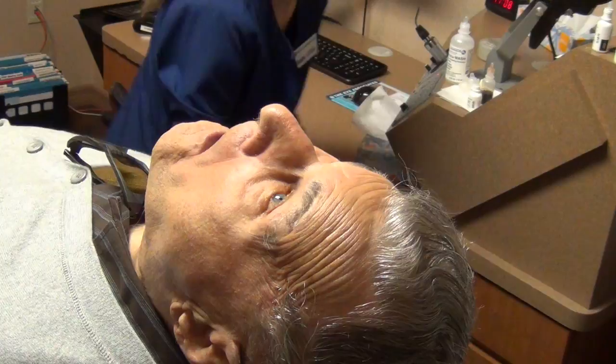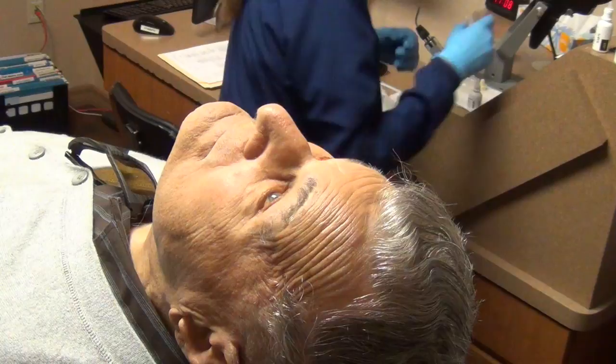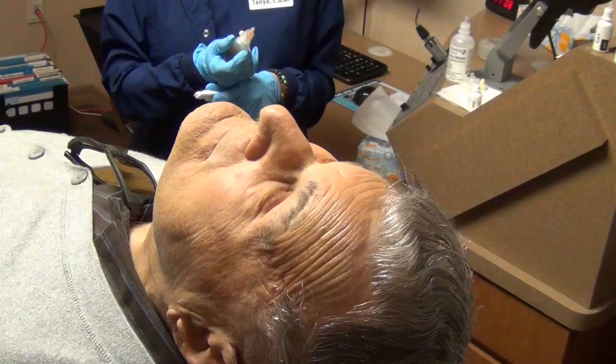This is where I clean your eye with the betadine swab — make sure your lids and lashes are clean. Go ahead and close your eye — perfect. Dr. Malley's drawing up your medication. Once we put the clip in the eye, there's no talking.